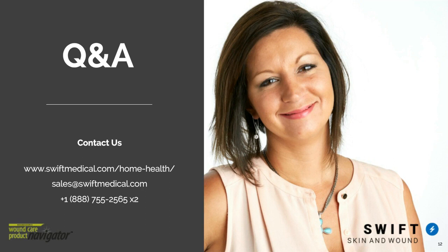Right. And how would you recommend usage, such as taking a picture of everyone's buttocks on admission or perhaps only hospital-acquired pressure injuries? Yeah, great question. So we can work with your organization to customize clinical workflows based on industry best practices. So we have a total skin assessment that is available in our application, which a lot of our customers use on admission to document what was present on the patient within the first 24 hours to defend those hospital-acquired or center-acquired pressure ulcers.